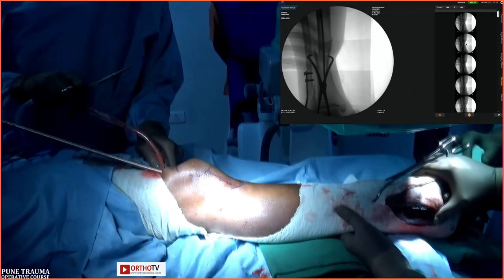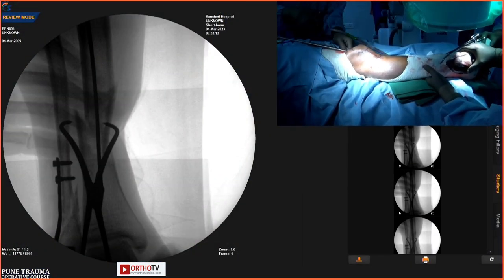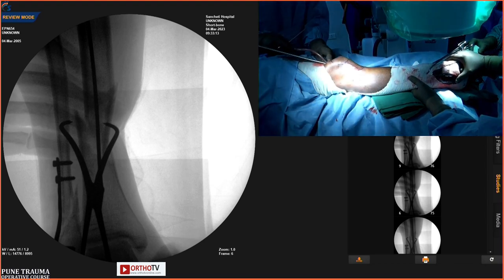One more tip is that when you are doing suprapatellar, you should always use constant suction because you are inviting debris into the joint.